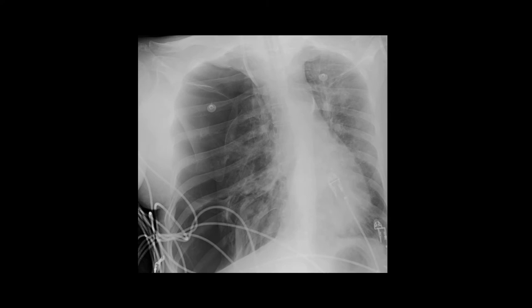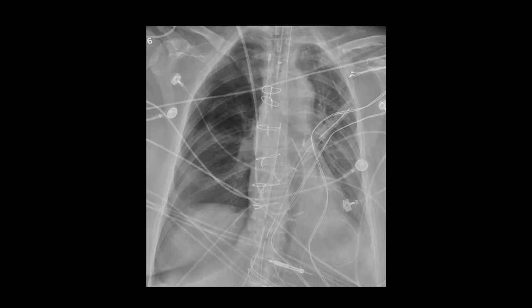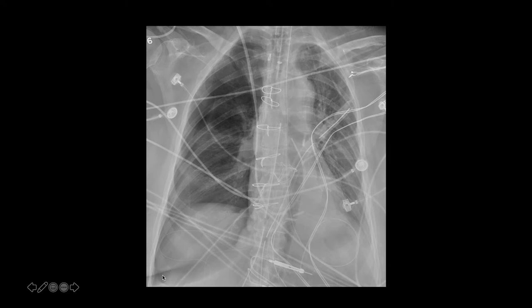Here is an example of a tension pneumothorax, which should be pretty obvious: there's mediastinal shift towards the left, a large air collection, and the hemidiaphragm is depressed. Here is another example of a pneumothorax illustrating the deep sulcus sign — you can see abnormal lucency down in the right base. In a supine patient, air collects anteriorly, and the most anterior part of the hemithorax is actually the more inferior part, so air can collect there and cause a deep sulcus sign.